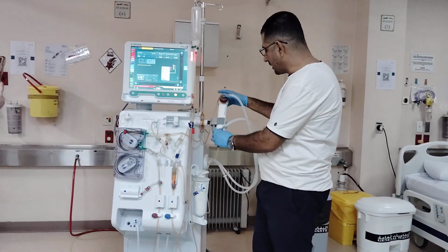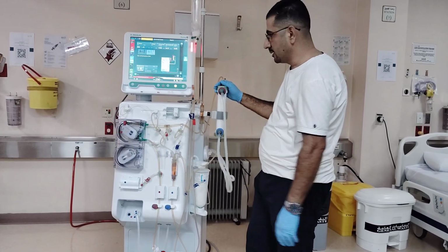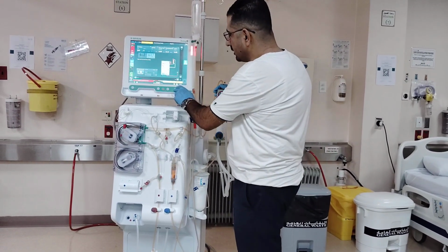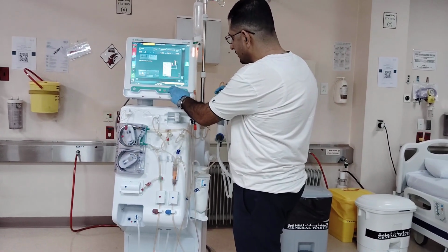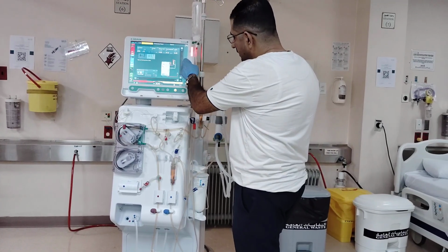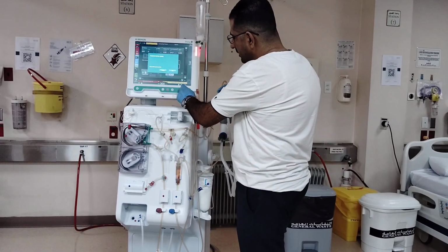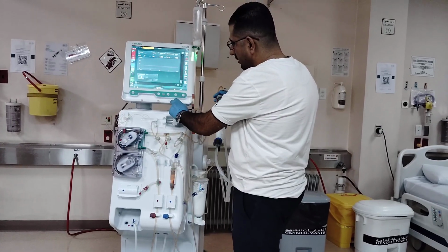And this is the time now to make the filter like this. And now because we don't have blood, I will press on the bypass to start the flow.